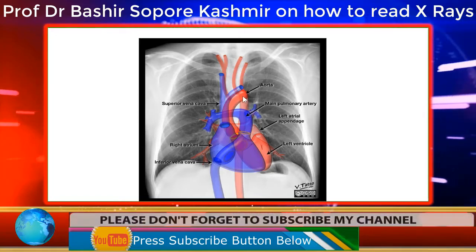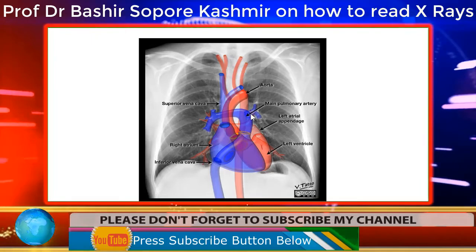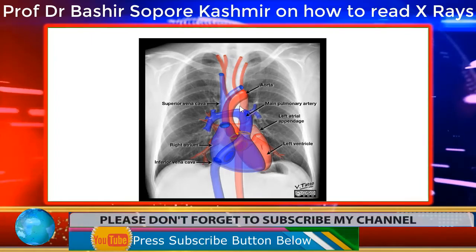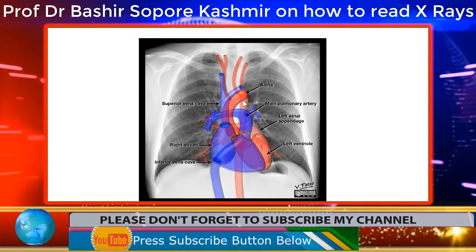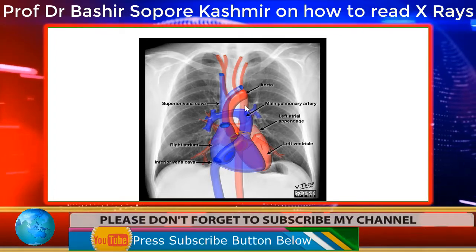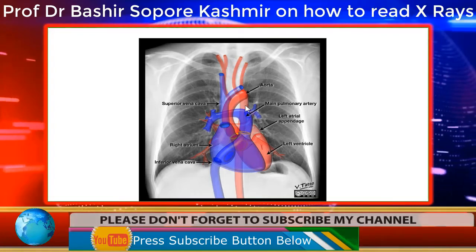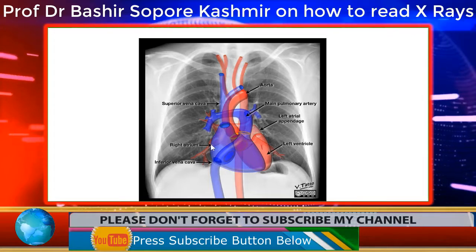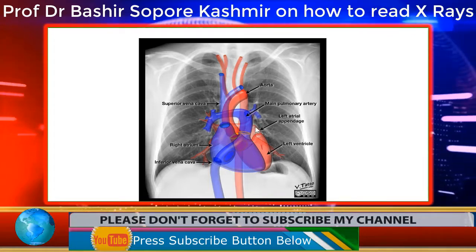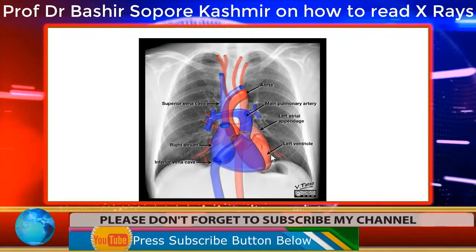And if you see between the aortic knuckle and the main pulmonary artery, there is an area, as I said already, that this area is called as aortopulmonary window. Now, for practical purposes, we take right side of the heart as right atrium and left side of the heart as left ventricle.